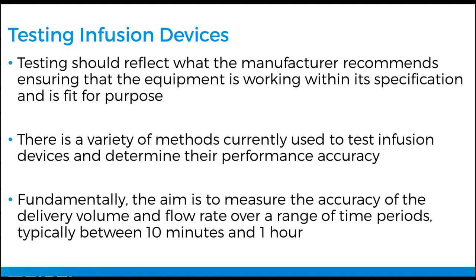Fundamentally, the aim is to measure the accuracy and delivery of these volume flow rates over a range of time periods. Because you can extrapolate, you don't have to do everything over an hour, even though the flow rates are determined per hour. You don't have to spend that type of time doing this type of testing.